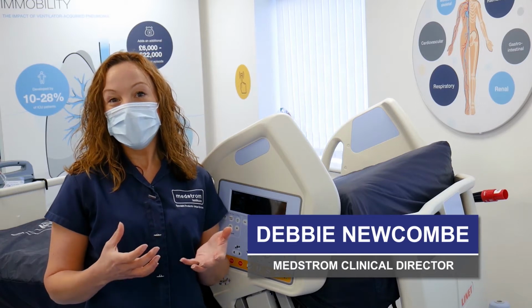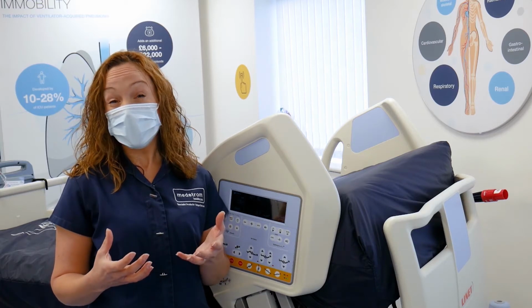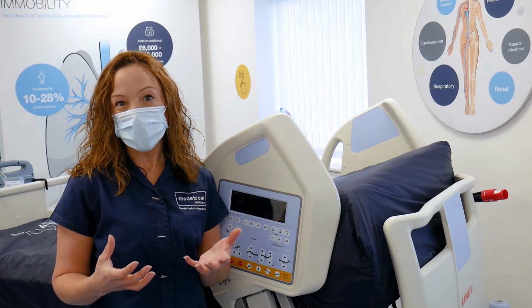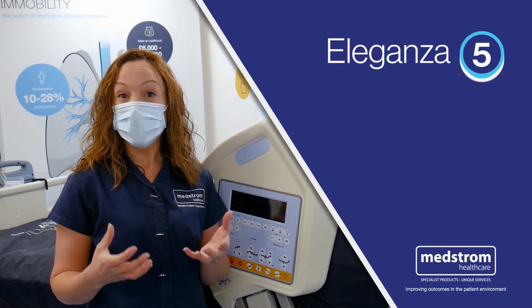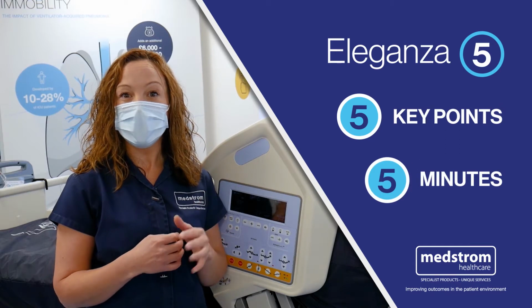We understand at the moment it's very difficult for us to gain access to help deliver training in the wards. We also understand that it's incredibly busy on the wards. So what we've tried to put together for you is a quick bite-sized 5 points in less than 5 minutes to help you.